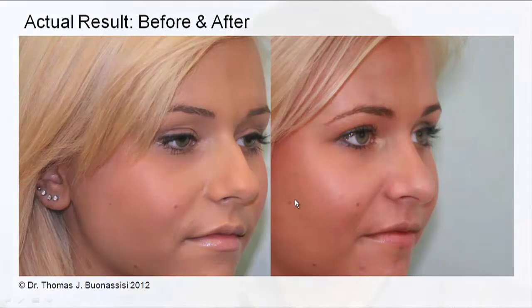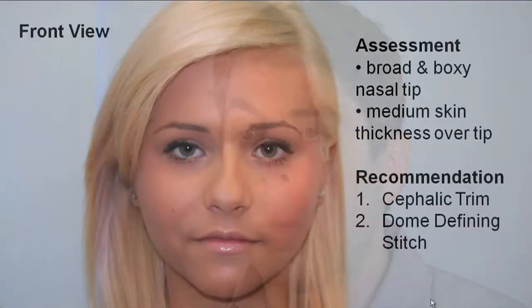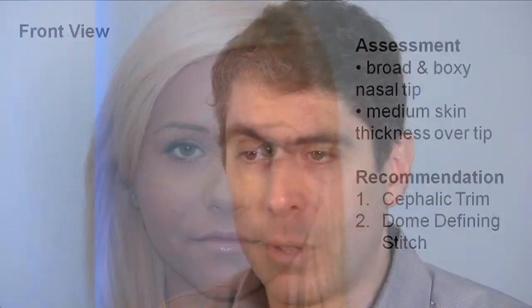I think the main limitation with computer imaging is that it's difficult to make changes to the nose on a front view. And that's because the imaging is a fairly simple software in that it moves background in and out. When you're looking at a front view, of course, the background is actually the person's cheeks and eyes, and you can't really move those in and out to simulate a change on the front view. So I think that's the main limitation, is that we really see the obvious changes on profiles, but not so much on the front views.